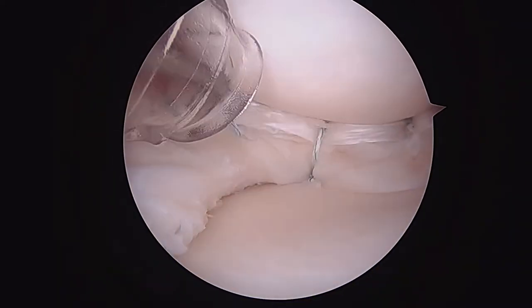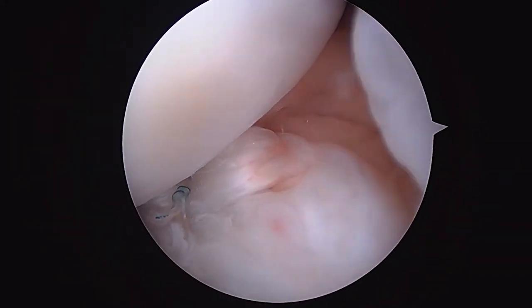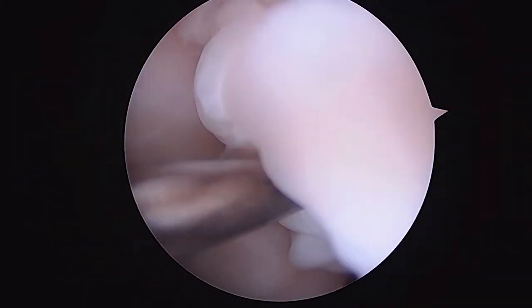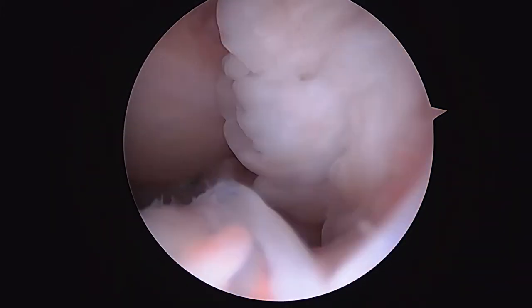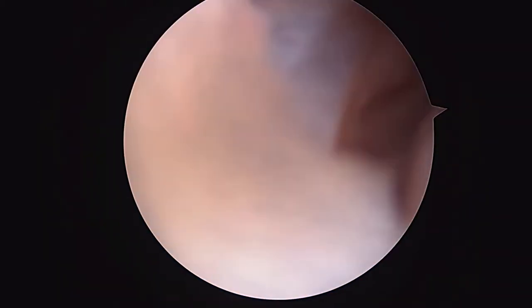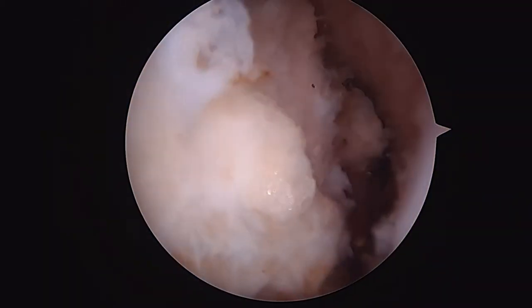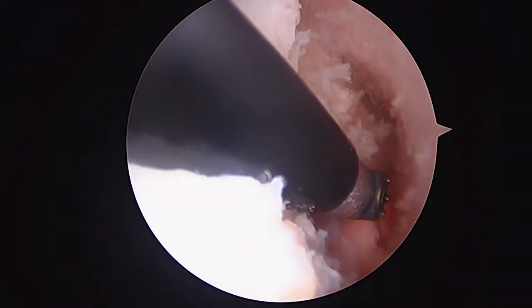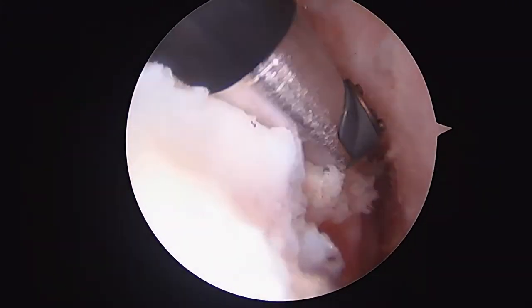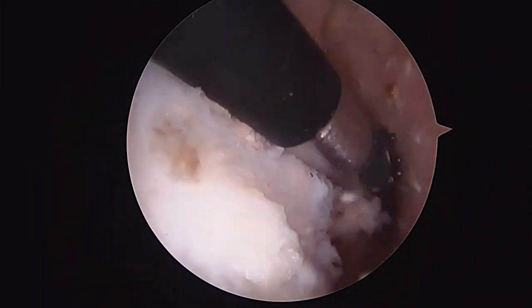That's the meniscal repair. Now let's look at what we've got going on with this ACL tear. I'm going to take the camera over to the area of the knee we call the notch, where the cruciate ligaments live. You've got to clear up a little bit of space first. This is where the ACL should be running right up in this direction — and it's completely absent. We spent a little bit of time clearing out some of the soft tissue so we can place our new graft right in this position.